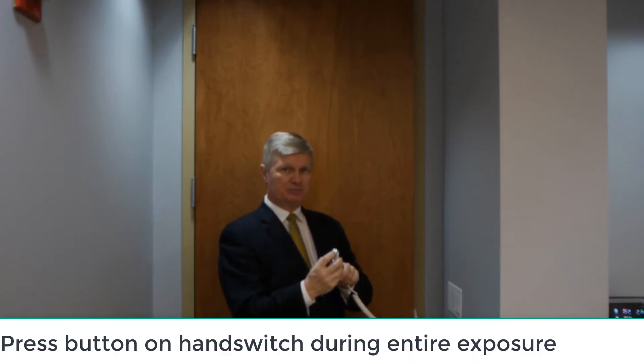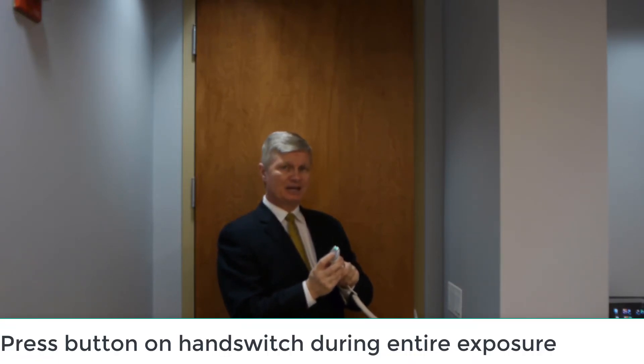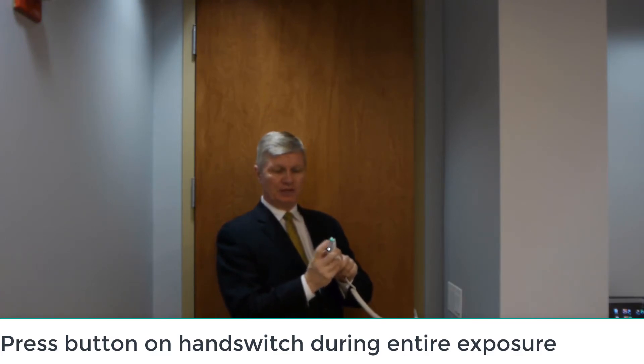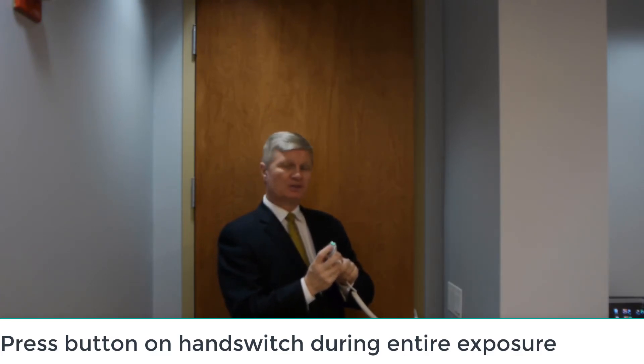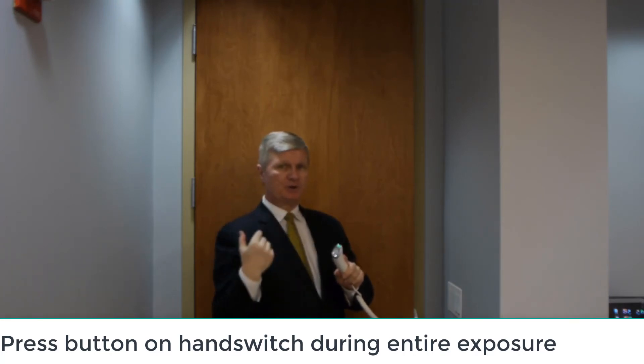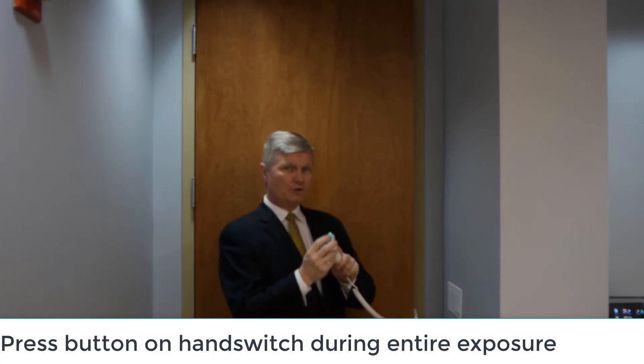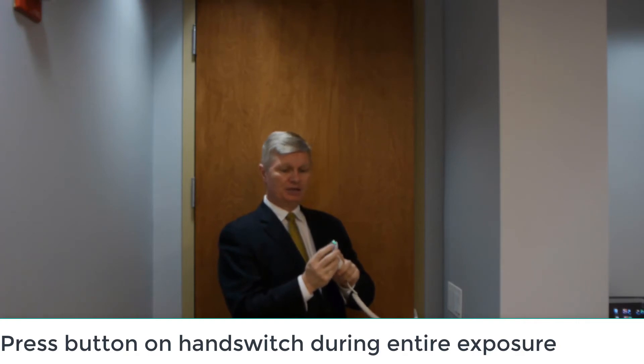After providing instructions for the patient, we see the green light is on and ready to capture our image. Press down on the button with equal pressure the entire time for 18 seconds. When the light is illuminating in orange, the device is capturing the image and rotating around the patient. When the orange light turns off or the green light turns back on, you can let go of the hand switch — image capture is completed.